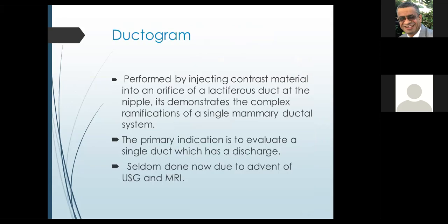Other modality, ductogram, performed by injection of contrast material into the orifice of a lactiferous duct at the nipple. It demonstrates the complex ramification of the single mammary ductal system. The primary indication is to evaluate a single duct which has discharge. Seldom done now due to the advent of ultrasound and MRI.